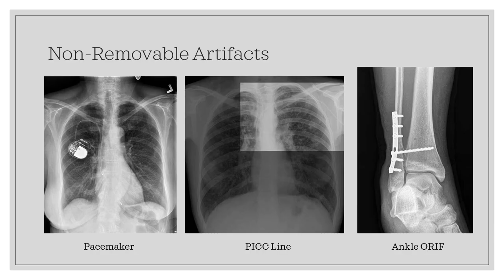Non-removable artifacts. For example, in image one, a pacemaker. Image two has a PICC line. And image three is an ORIF of the ankle.